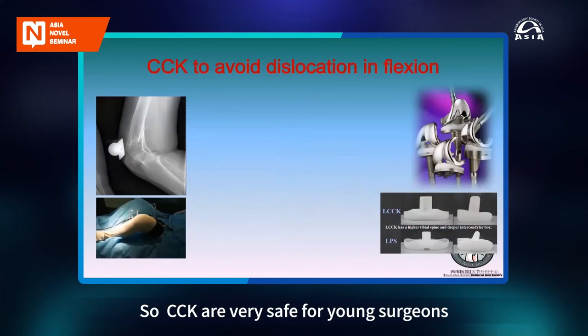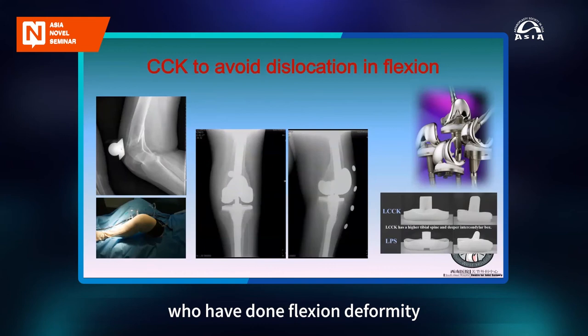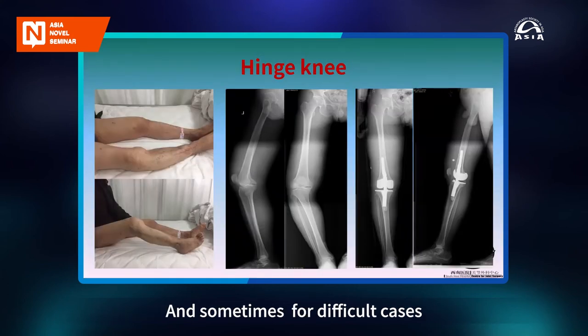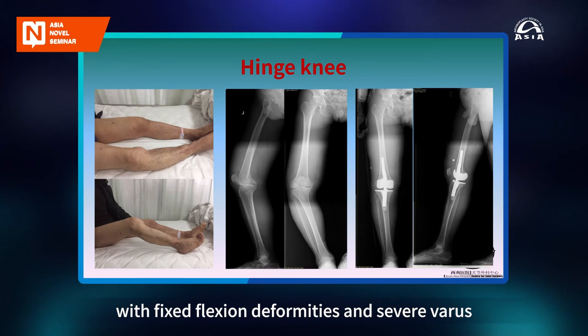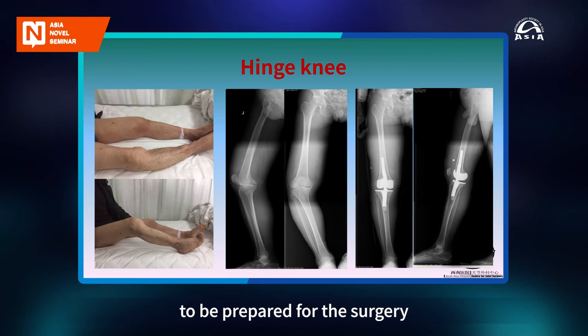So CCK is very safe for young surgeons with very little experience in flexion deformity, and can help avoid dislocation or other complications in flexion. And sometimes for difficult cases with fixed flexion deformities and severe varus, and maybe after all the soft tissue release, we may need a hinged knee to be prepared for the surgery.